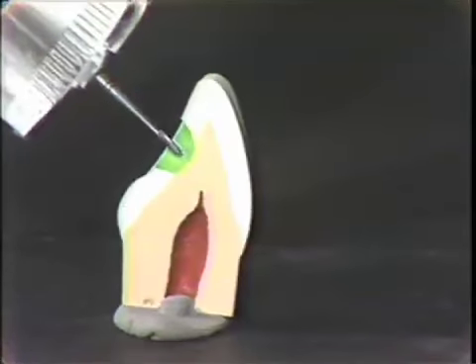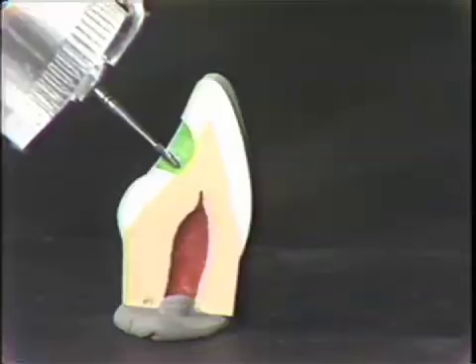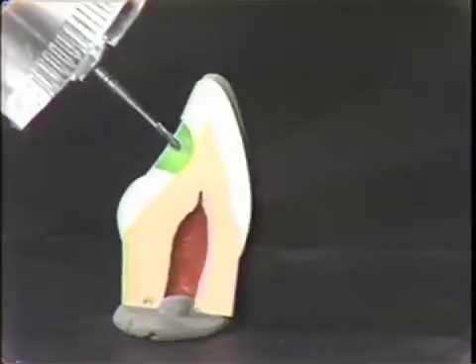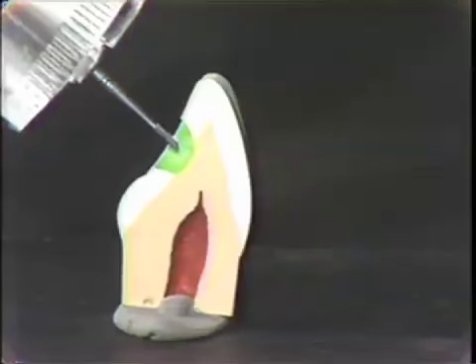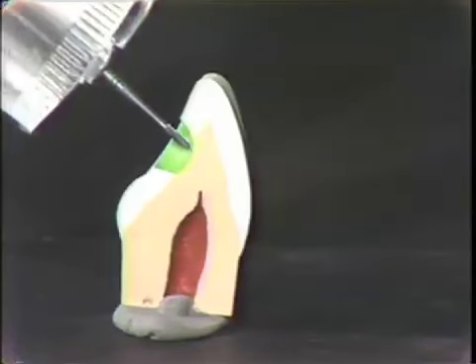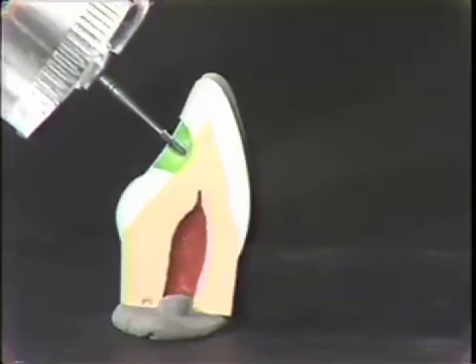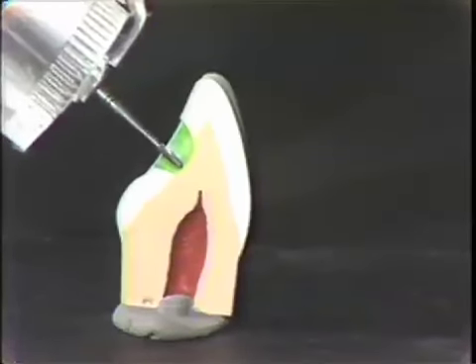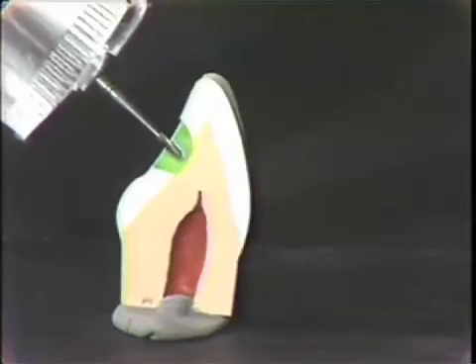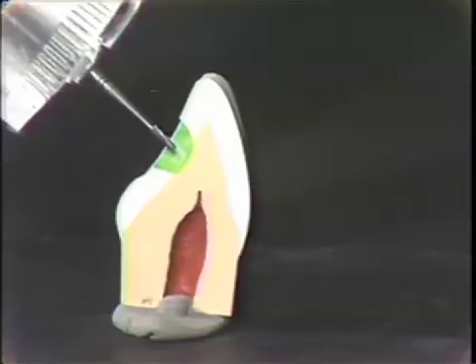You hold the burr at right angles to the tooth surface so that it won't skip across the enamel and gouge the tooth, and also so that you can form nice right angle margins if you're going to restore this tooth in acrylic. Once you've reached the dentin, the level of the dentin, you can put your high speed aside because you're done with it.